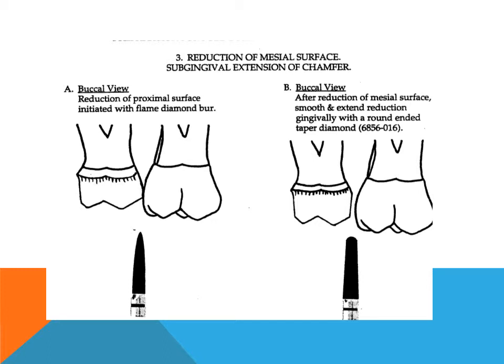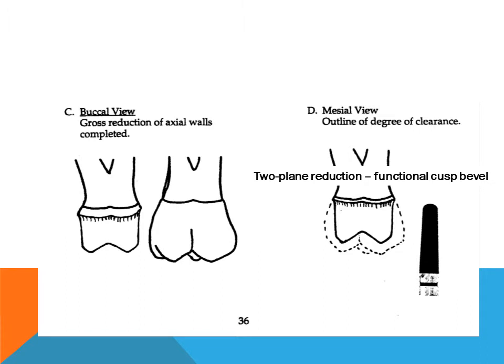When sufficient access has been obtained with the flame diamond burr, the reduction of the mesial wall is smoothed and a chamfer established with a diamond burr. When the gross reduction of all axial walls is completed, the cuts should terminate supra-gingival, or slightly occlusal to the crest of the gingiva. With sub-gingival extension, a K-type diamond burr held parallel to the long axis of the tooth is used to remove lipped margins and create a smooth chamfer.